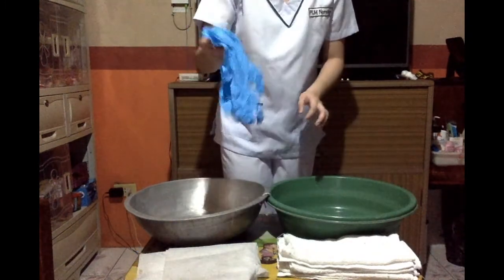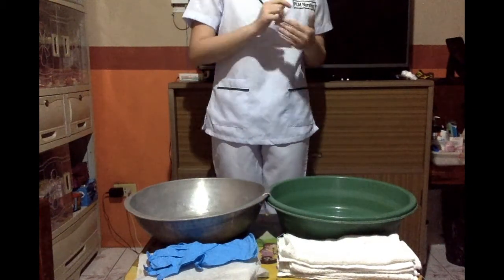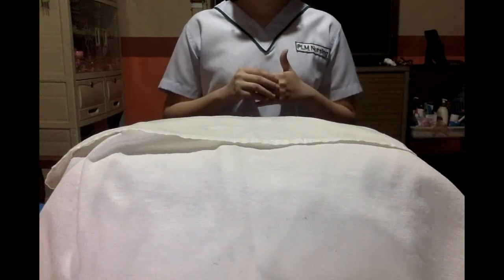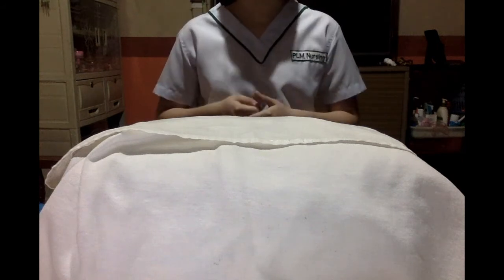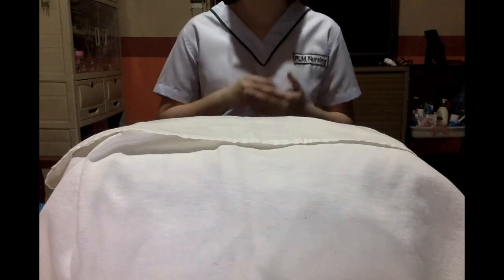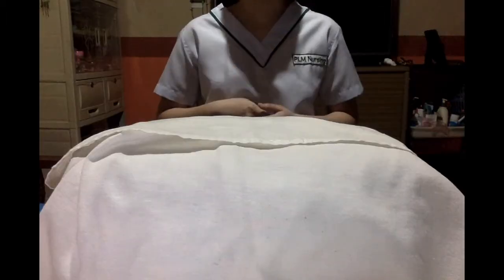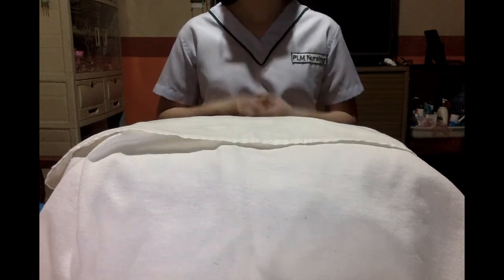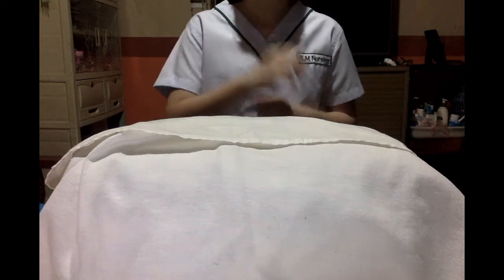I also have here non-sterile gloves and also a linen saver and a large towel or large cloth for draping. I also have here the indwelling catheterization set. So this set contains a pair of sterile gloves, a specimen collection container, the Foley catheter, wherein the tubing and the drainage bag are already connected. And for the females, 14 to 16 French catheter is usually used, cotton balls, 2 drapes, antiseptic solution, forceps, lubricating jelly, and a pre-filled syringe which will be used for the balloon inflation, which will be done later on.